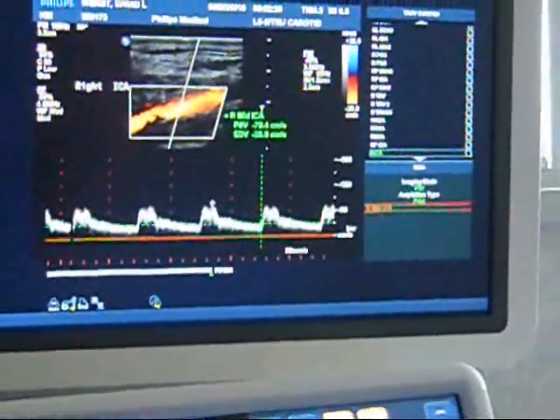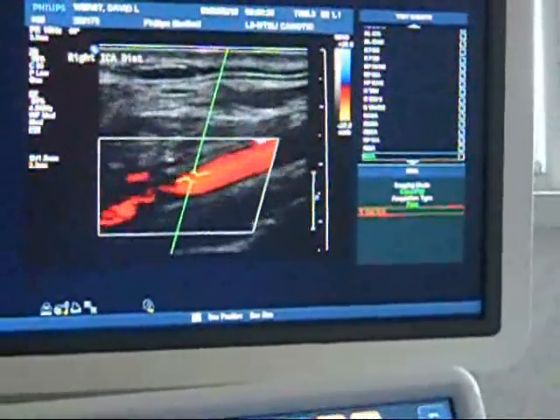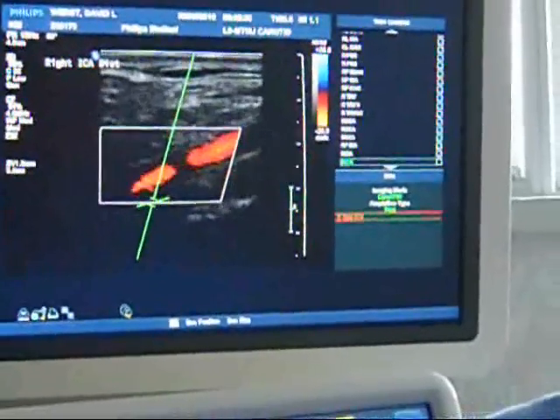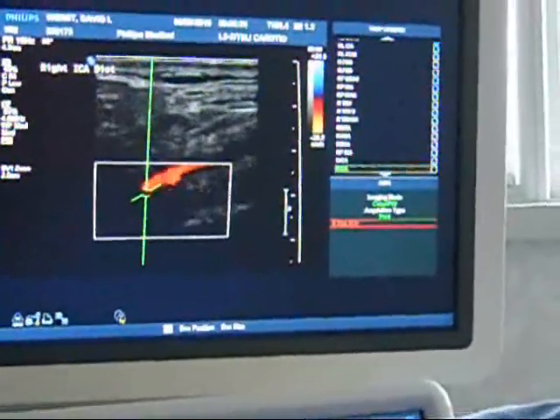That is the velocities of the blood going through those arteries. The tighter the spot, the higher velocity — kind of like a water hose. Got a lot of gunk in that water hose, the water is going to flow faster through that one area. That's what we're looking for when we're doing these Dopplers like this.